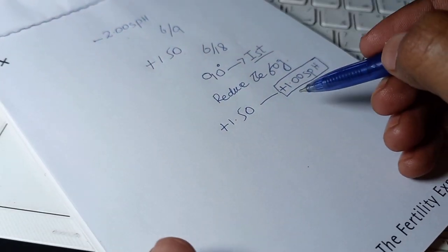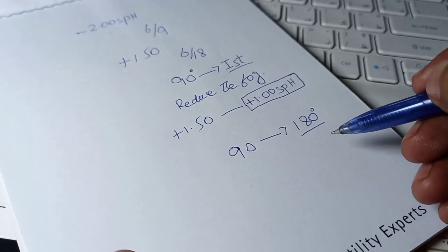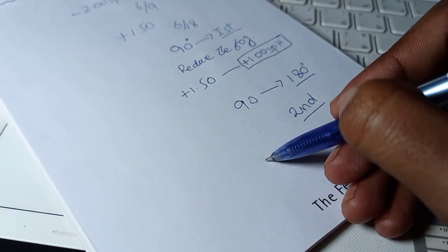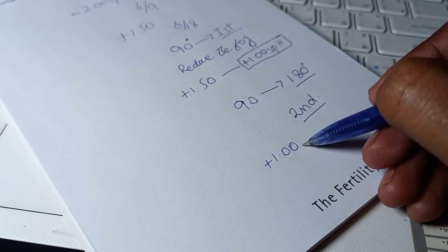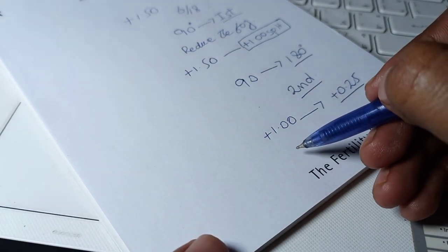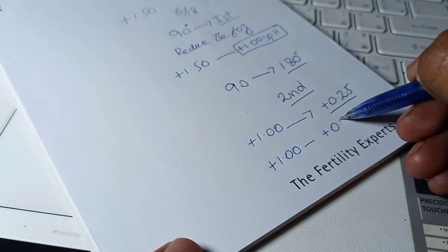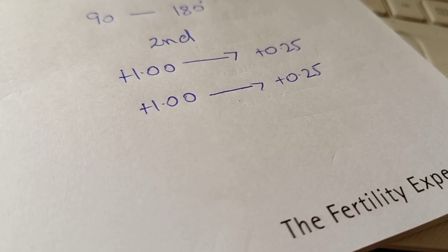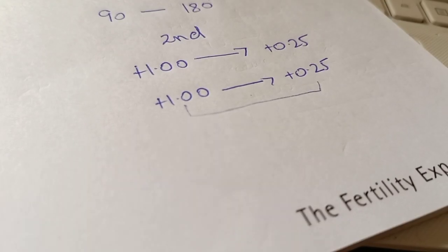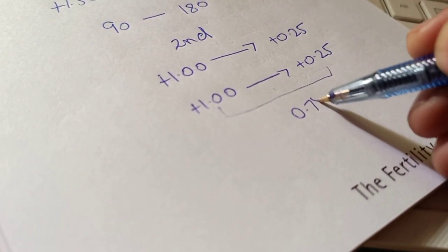We then rotated the stenopic slit from 90 degrees to 180 degrees — our second principal meridian. We reduced the fog again; the residual fog started at plus 1.00 and was reduced to plus 0.25. So at the first principal meridian our residual fog was plus 1.00, and at the second principal meridian our residual fog was plus 0.25. To find the cylindrical power, we move from plus 1.00 to plus 0.25, and the gap between these values is 0.75.